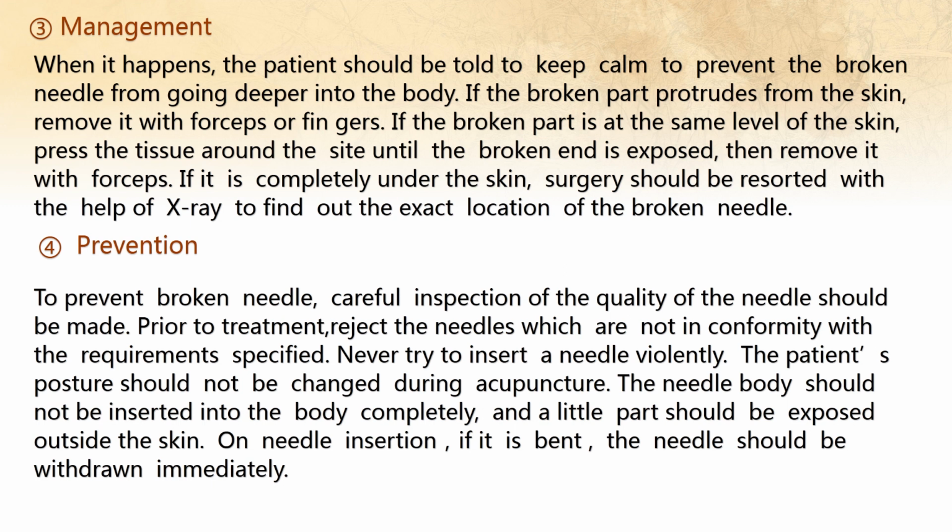Prevention. To prevent a broken needle, careful inspection of the quality of the needle should be made. Prior to treatment, reject the needles which do not conform to the requirements specified. Never try to insert a needle violently. The patient's posture should not be changed during acupuncture. The needle body should not be inserted into the body completely, and a little part should be exposed outside the skin. On needle insertion, if it is bent, the needle should be withdrawn immediately.